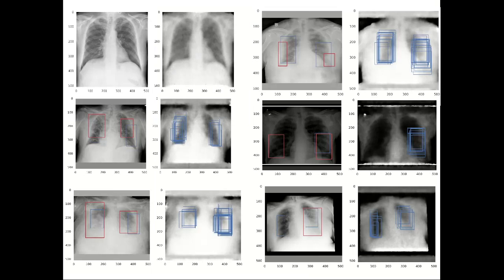Here you can see some examples of the predictions of my trained model. I took the predictions from one session run on 20 images randomly chosen from the test set, and then tried to pick a fair representative 6 of them.